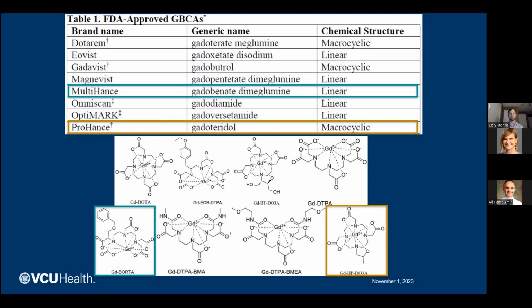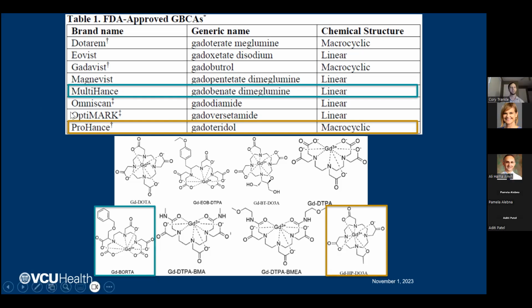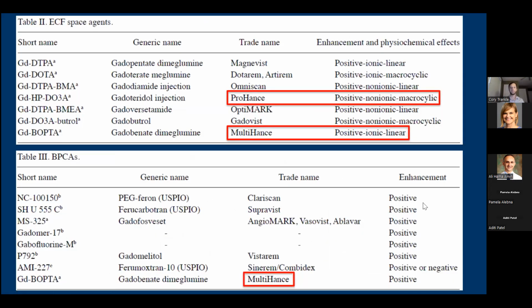It's more, I think, if the study is combined with an abdominal study, or if they're specifically looking at things like angiography, where you want to see the vascular space very clearly. Gadavist right here is the only one. I tried to check right before giving this conference, just to make sure this is still true, but as far as I'm aware, Gadavist is the only one that's actually FDA approved specifically for cardiac scans. Before that, everybody had to put a disclaimer in the talk that they were going to discuss the off-label use of gadolinium-based contrast agents for cardiac exams. But as of a couple of years ago, Gadavist was approved specifically for cardiac exams.